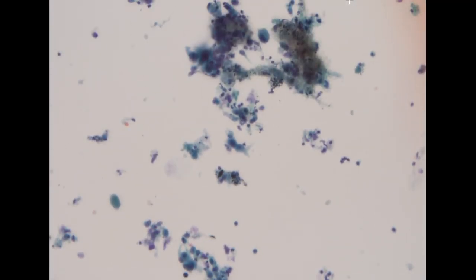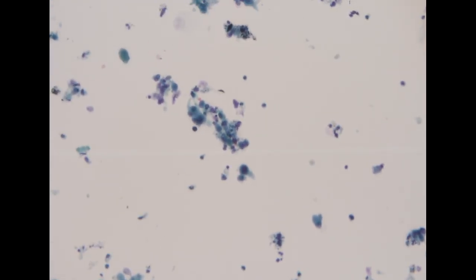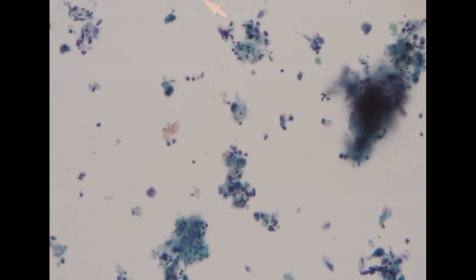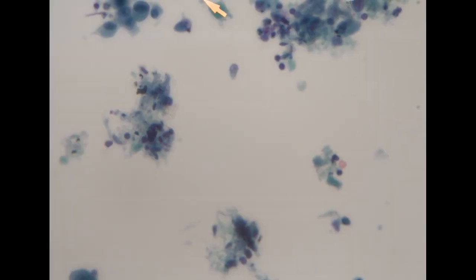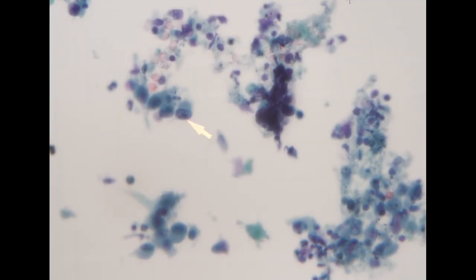And then we go to the background. The background was very, very dirty. It shows quite some like a necrotic debris. So this background is actually not good, okay? And we then go to higher power, and we do see a lot of these atypical cells, some with eccentric nucleus and with prominent nucleolus.